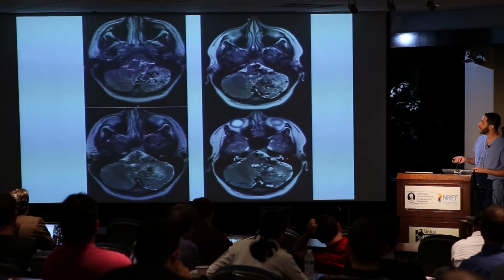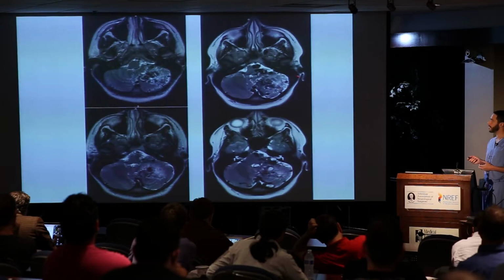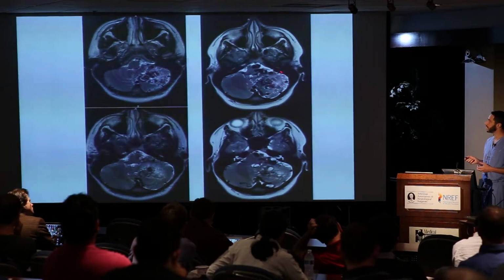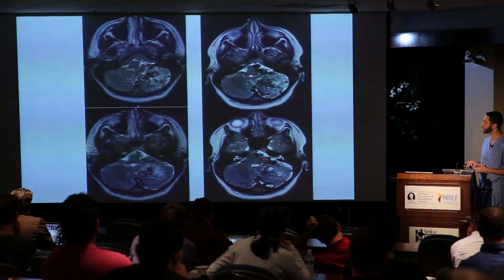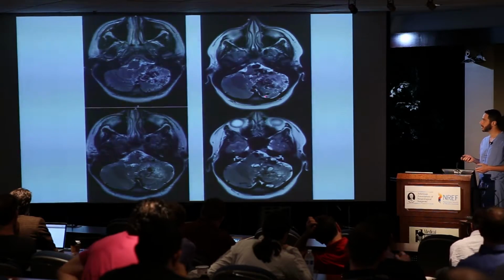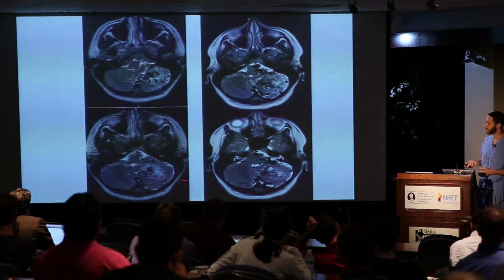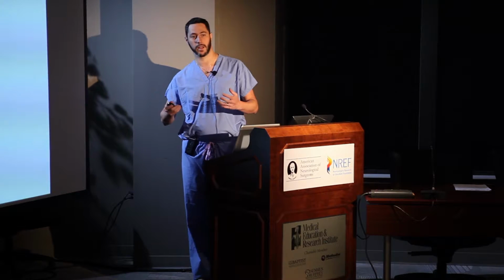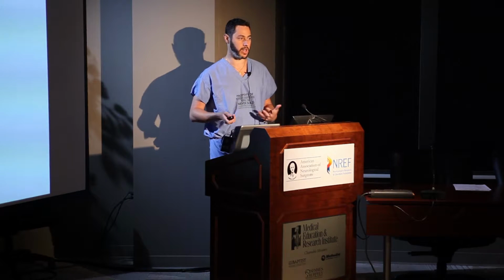This is now. What catches my eye in this MRI is that the veins are massively engorged around the medulla, right at the exit of the 7th nerve. And why are the veins bigger? She's thrombosed this vein, right? There's venous disease. This isn't just an artery going into a bunch of tangles and coming out. It's an active disease process that can change over time. So these kinds of details are important.